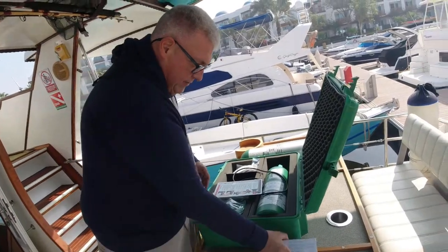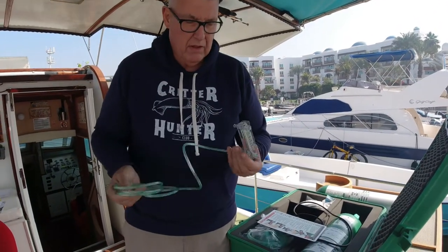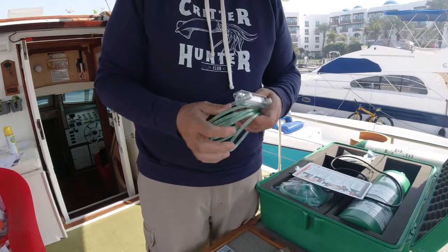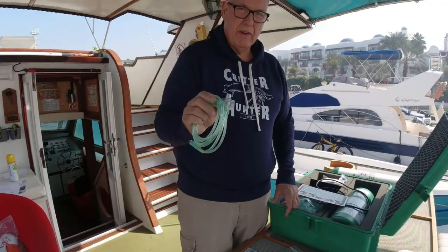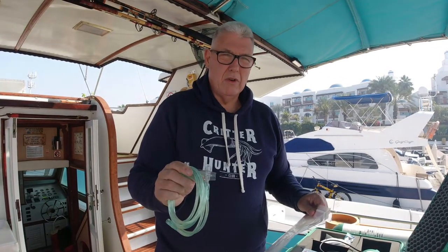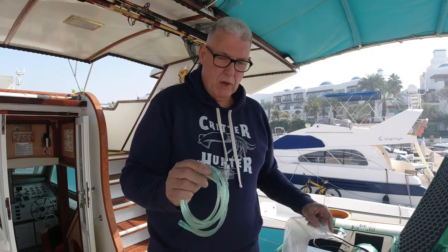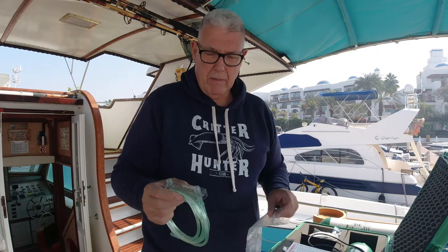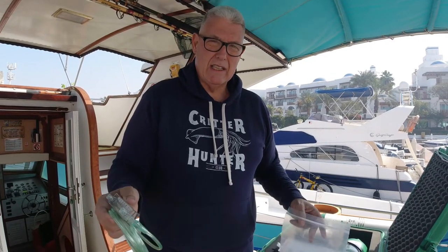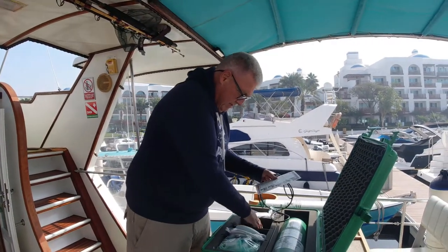Here's something interesting I've made up: a flow meter connected to a hose from a non-rebreather mask. This allows me to regularly check the flow of the regulator — probably every six months — to confirm that 15 litres per minute is coming out. I checked this one and it was about 16, so I'm happy with that. If it was less, it would mean we need to replace or service the regulator.